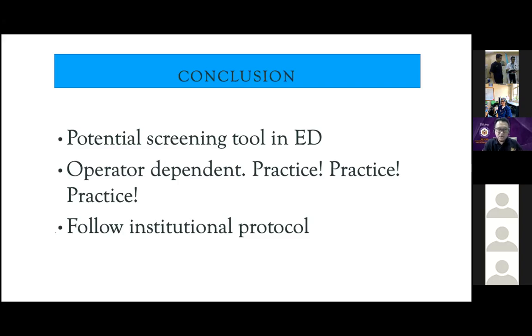And of course, regardless of TCD or carotid Doppler, it's operator dependent. So we need to practice, especially the spectral Doppler. But I guess with good training, we can perform that very well. About the spectral Doppler, just bear in mind your Doppler angle. I know some institutions have their own protocol, so just follow your institutional protocol. What I mentioned here is basically just a screening tool, as a focus practitioner, to identify atheroma as well as carotid artery stenosis.